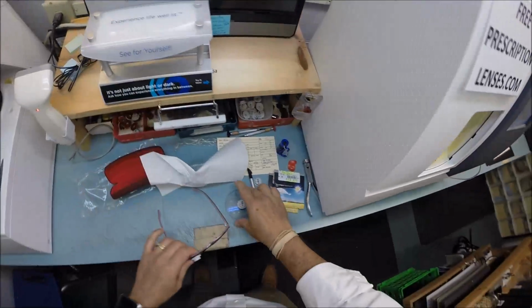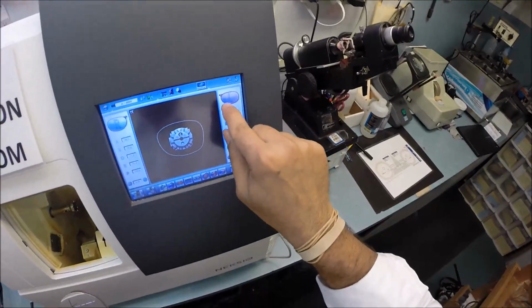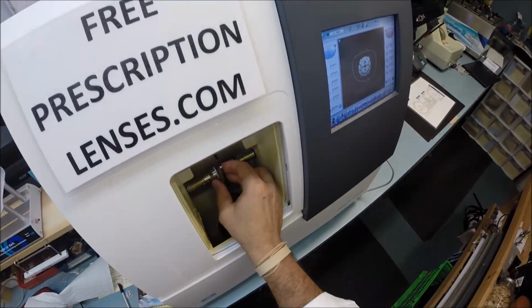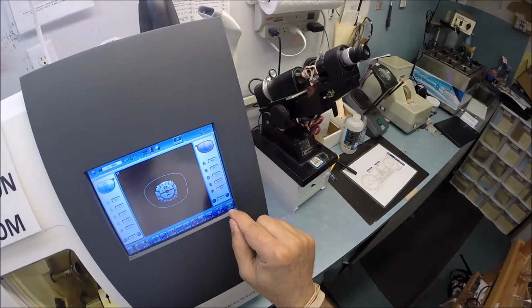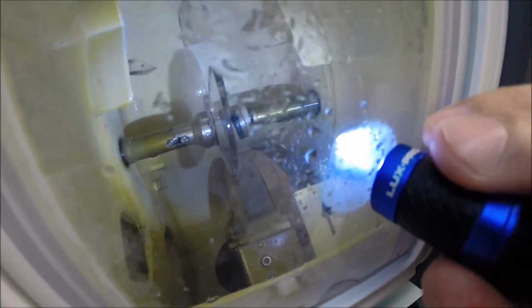It fits. All right, let's go ahead and start cutting the L lens. Flip that over to L. Put that in. I'm gonna take a little bit off and hit the start button. Just like before, the door closes, the clamp shuts, and then the lens is going to be traced by the 2 white styluses. Let me give this an angle.